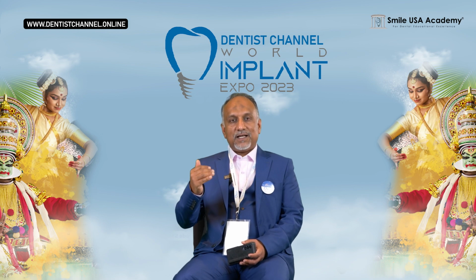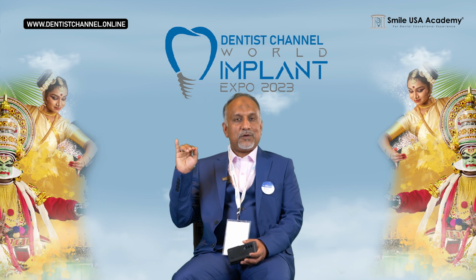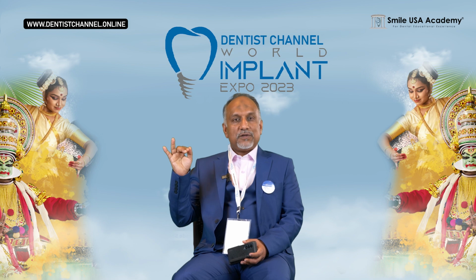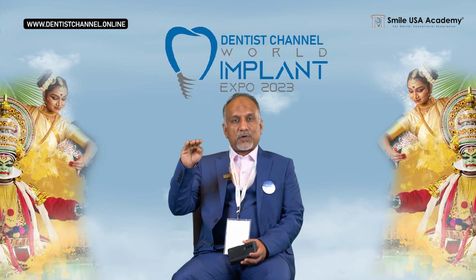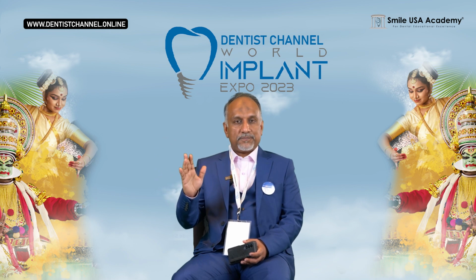Then the third tip is to do a proper diagnosis before you jump to any conclusion. For that you may need X-rays, you may need an OPG, you may need a CBCT. Whatever is needed for that particular case, you have to get it. It is not a matter of the patient not being interested or me not having the time. It's not that way. This protocol has to be formulated in our clinic. Whatever is necessary, we have to get it.